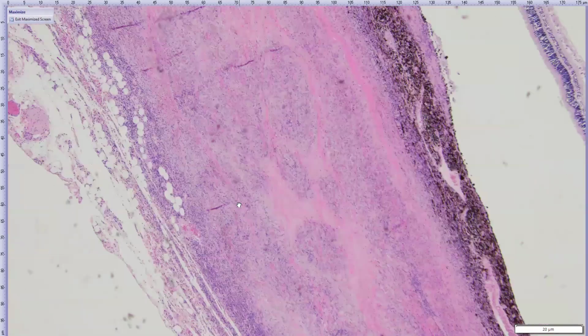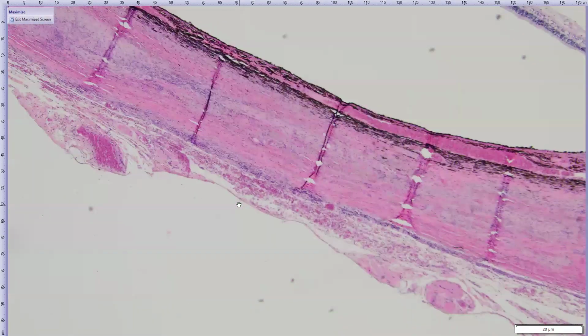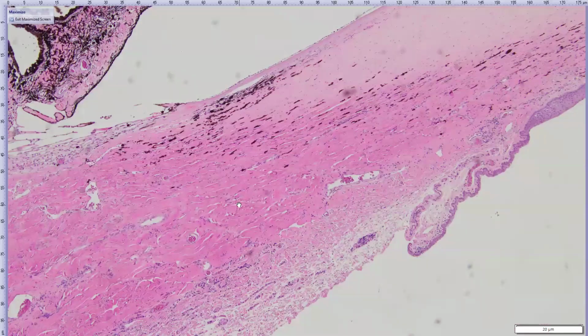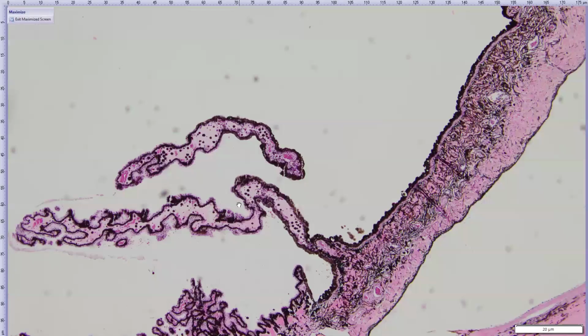And it's also on the other side over here. We just have more of it, and it starts to peter out a little bit, but there's still affected collagen as we go more anterior. Rest of this eye is somewhat unremarkable.